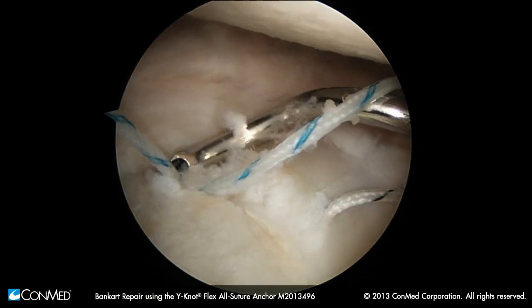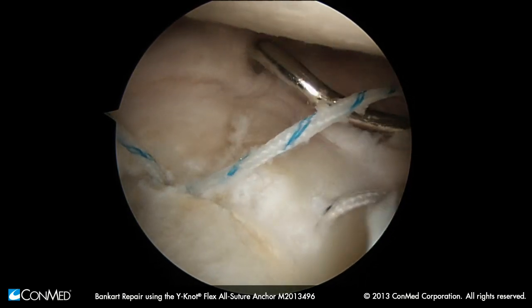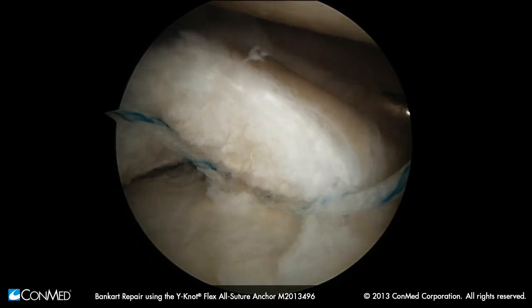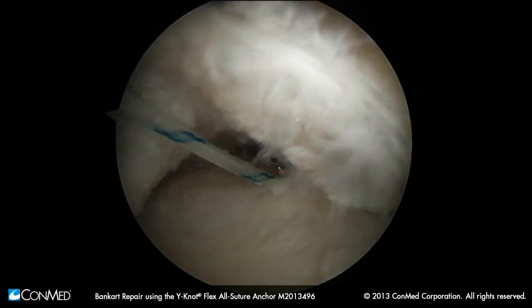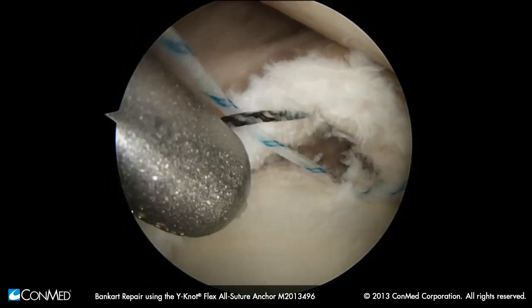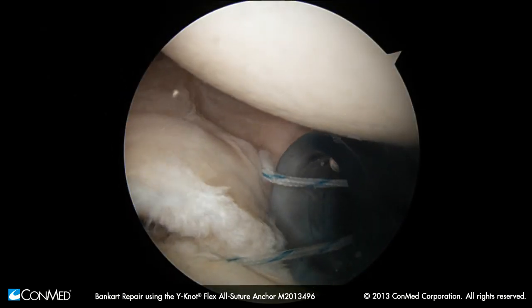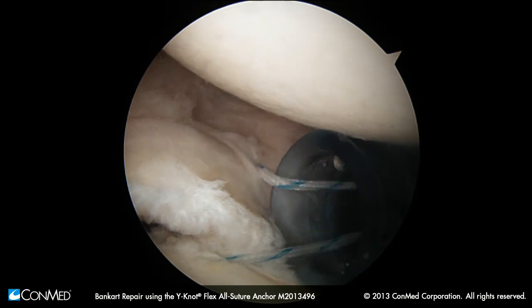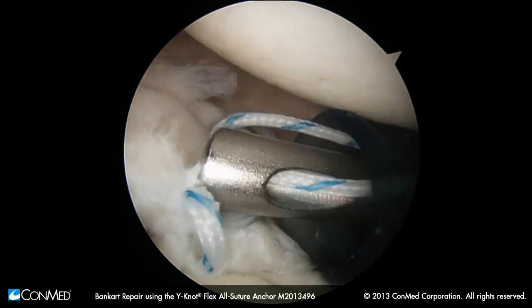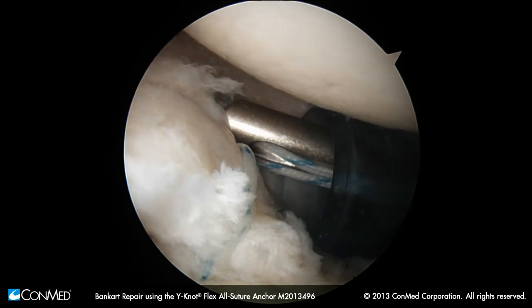With muscle memory, I'm sitting here and I say to myself: I need to get back to this point. At which point I'll pronate, go down, and get some capsule and some labrum. In this case, we won't be doing a pinch tuck and we'll come right back to where we came. When you feed these shuttles, you don't want to yank them through — you want to send them through and take up the slack with your grasper. We should have fairly smooth sailing with our post limb here. You just tug on the post limb to confirm which one it is. We use the SMC. I'll set that knot down where I want it to sit and pull backwards to advance the labrum.